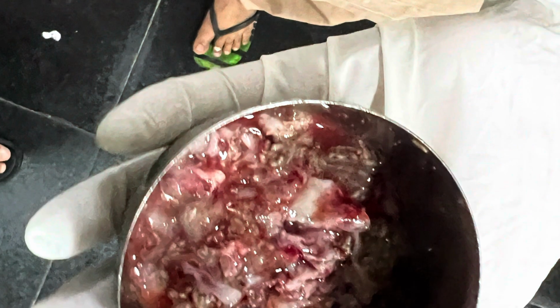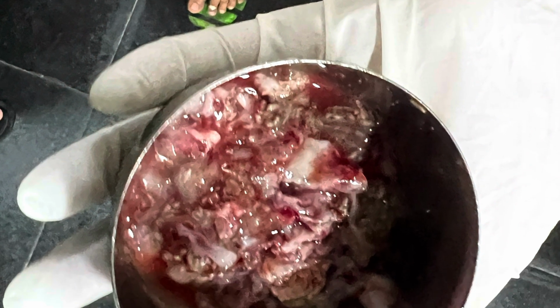You should avoid damage to the supraorbital nerve and orbital contents during exenteration of this supraorbital cell. After complete exenteration of the frontal sinus and this supraorbital cell, you can see this frontal glow. This sign is known as Friedman sign, and this is suggestive of completeness of the surgical work in the frontal sinus and supraorbital cell. And you can see this allergic component in the allergic fungal rhinosinusitis cases.